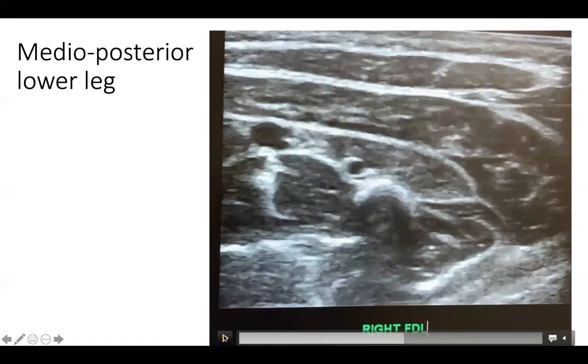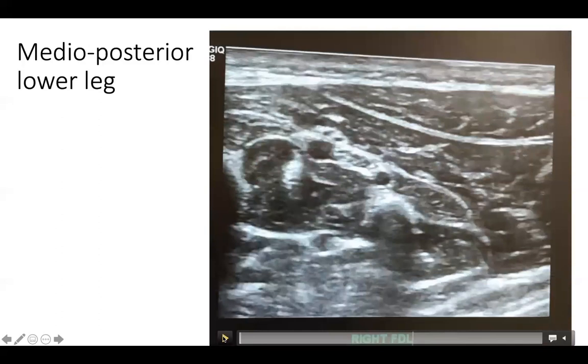Were you able to figure it out? So I'm going to go back to the beginning. So let's start to study again. Your home base is always tibia and fibula. Between tibia and fibula, we have posterior tibialis, the bathtub muscle. Looks like a bathtub, so we call it the bathtub muscle. When you approach from the medial side, sometimes it's the chair muscle.